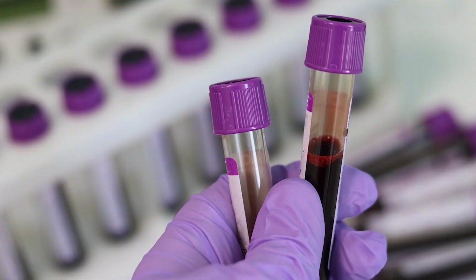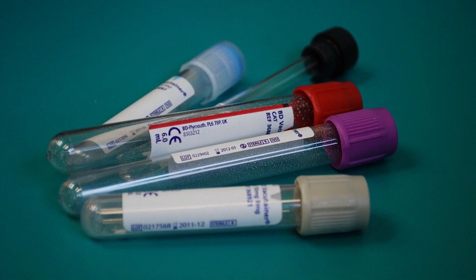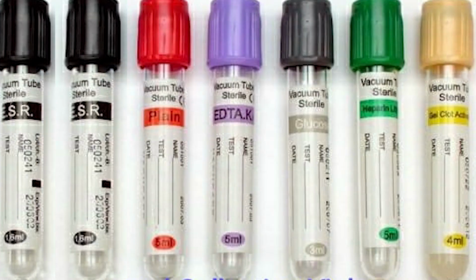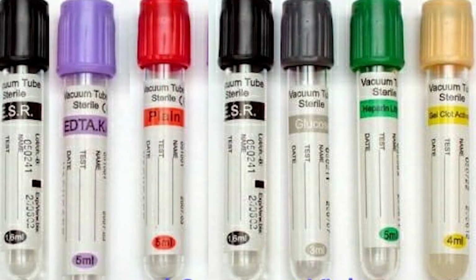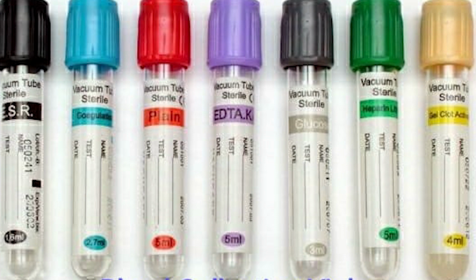vacuum present inside the test tube that makes the exact proportion of anticoagulant to blood ratio. Vacutainer methods avoid external contamination of samples by microorganisms, but sample contamination chances are there between the sample collection tubes. So the order of draw becomes important to minimize the contamination of anticoagulants present between the tubes.